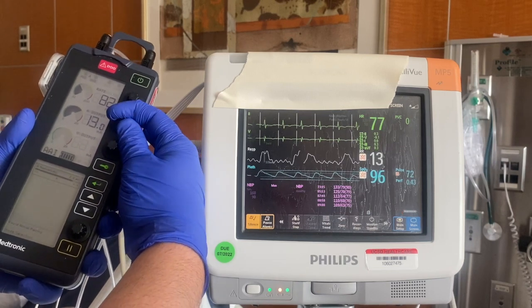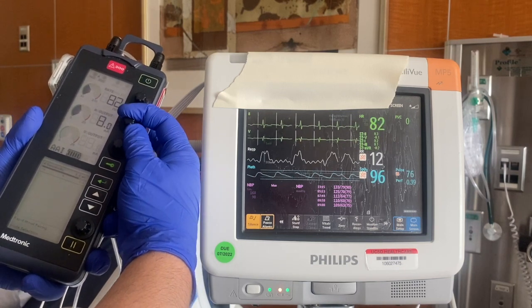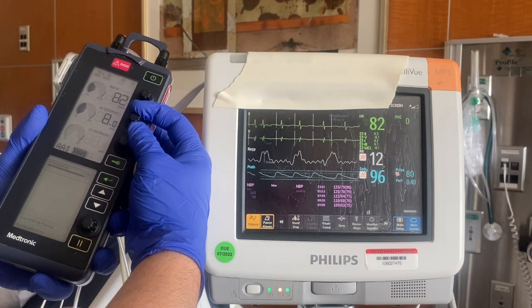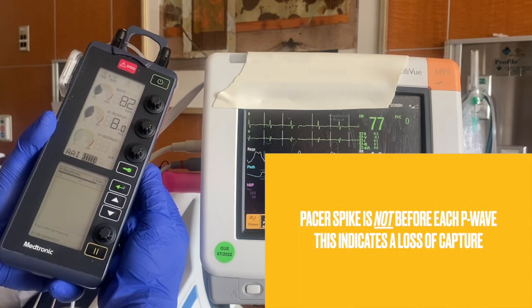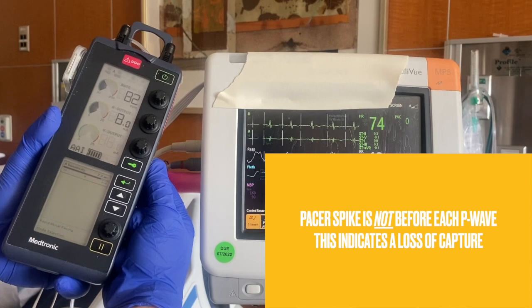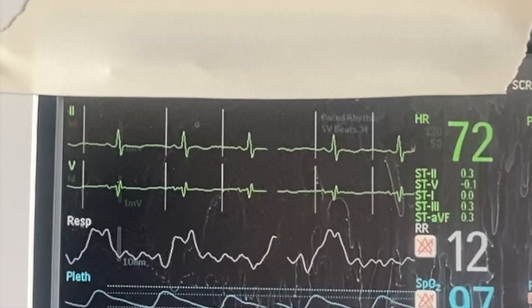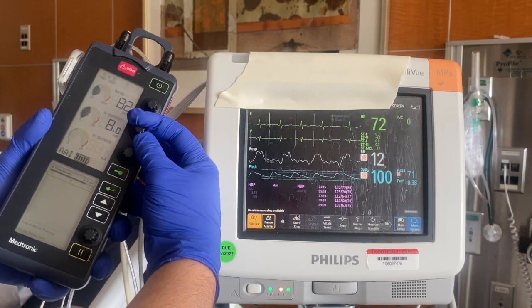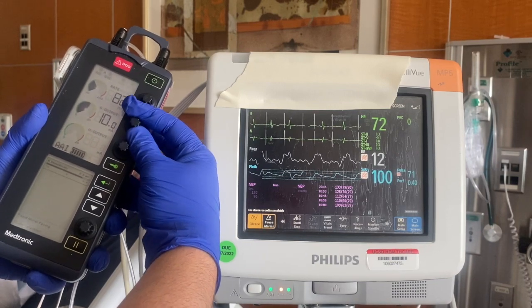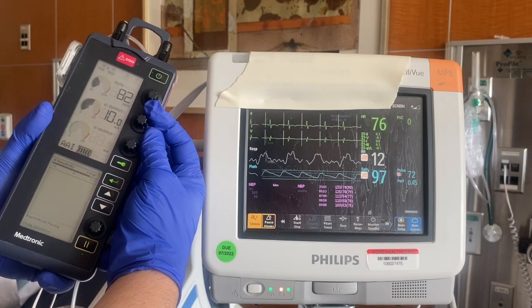At this point, you are looking at the monitor and noticing when the pacer spikes no longer appear or they begin to drop beats. Alex has placed it at 8 milliamps and you can see there are some dropped beats — you no longer see a consistent spike before every P wave. You're going to increase the milliamps by turning clockwise until you get capture and have a hundred percent paced rhythm. This will be your stimulation threshold.